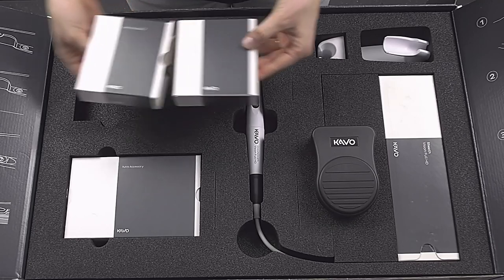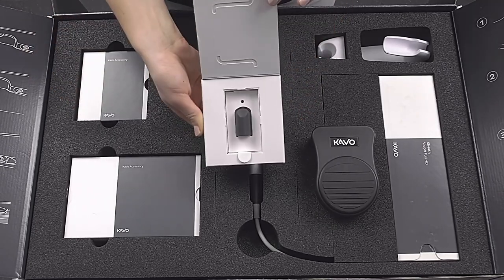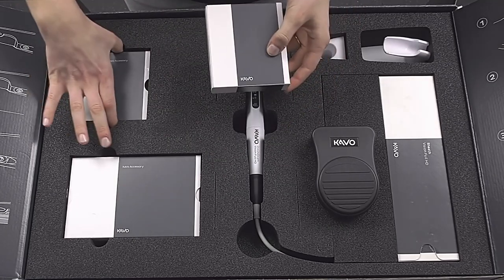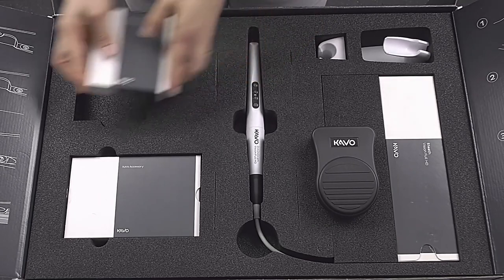The fluorescence cover can be attached to the handpiece when taking images in fluorescence mode, in order to create images with just the right amount of light. We also recommend turning off the treatment unit light while using this mode.